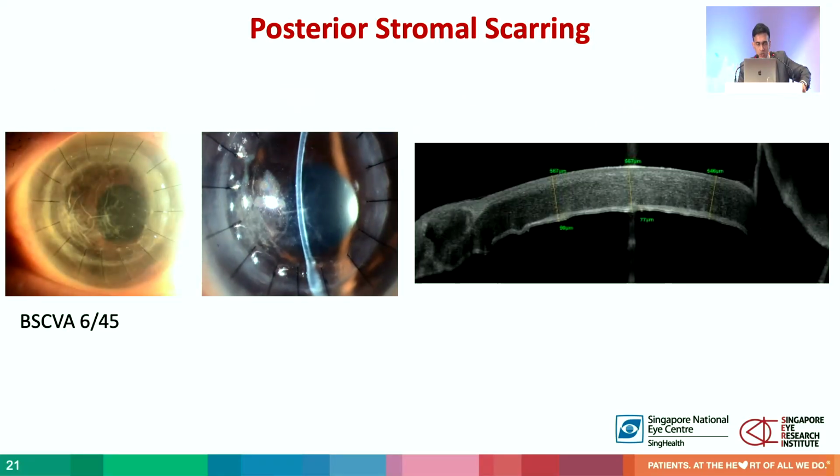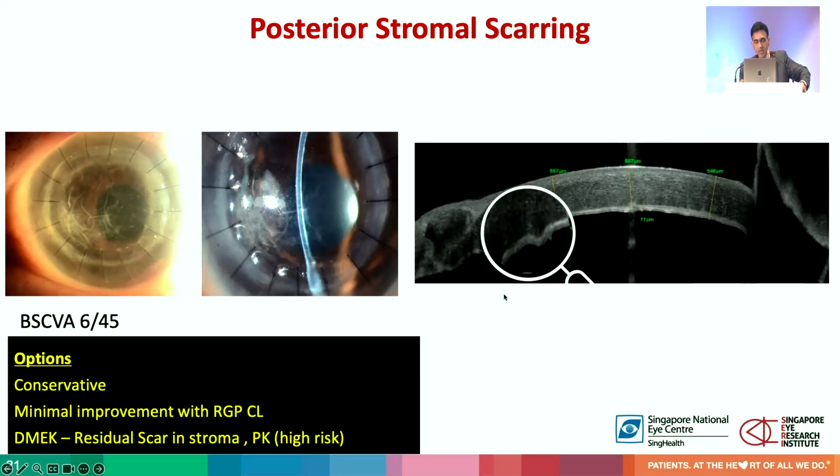This is the OCT, and you can see the full thickness folds over here, and again, in slightly higher magnification, you can see Descemet's membrane over here, and these folds go well beyond that, up into the base of the DALK stroma itself. So again, if you just strip away Descemet's membrane over here, you're not going to be able to get rid of these folds. So in this situation, there's several options. Of course, you could convert her to a PK, but obviously it's a high-risk case with herpes simplex and one area of vascularization, so we wanted to do something else.